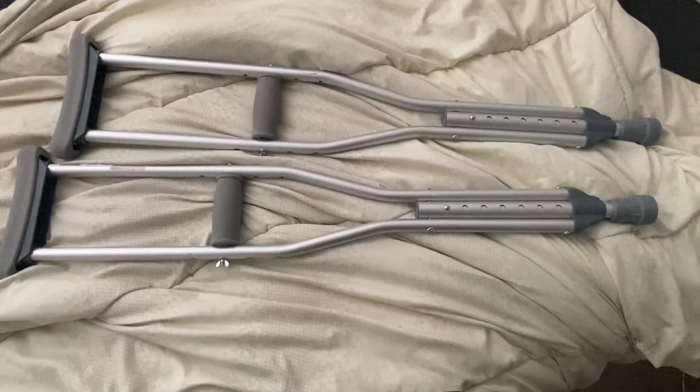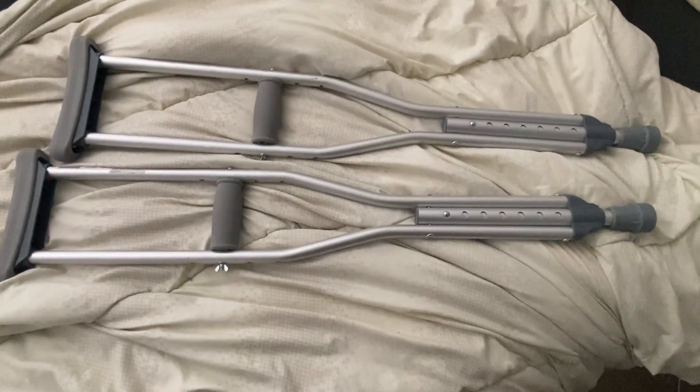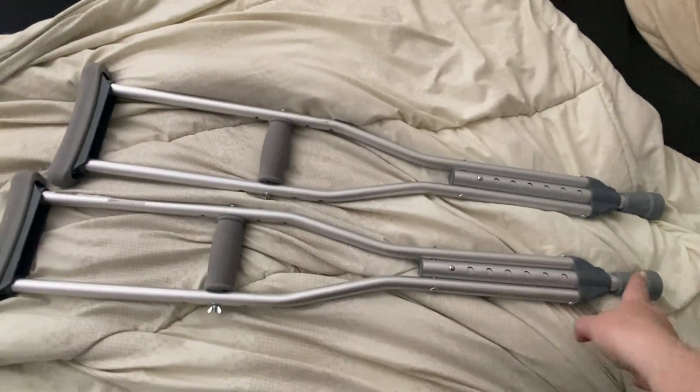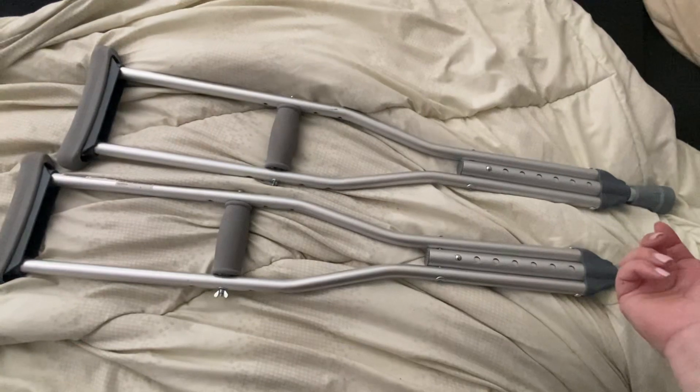So these are good for heights of 4' to 4'6". These are really nice because they have little adjustments so you can make them longer or bigger. They have a big rubber stopper here so it makes it really easy for people to walk.